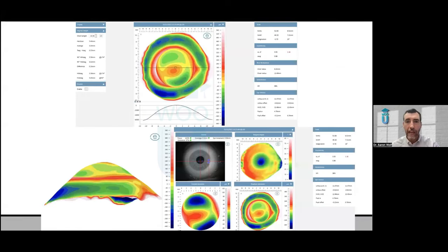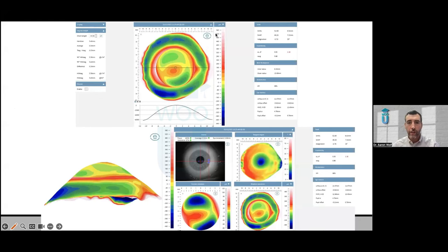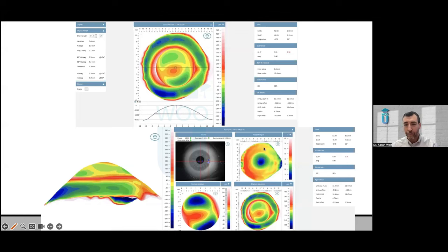These are examples of Fourier projection profilometry maps. Where the red ring is marks your cornea. With elevation maps, warmer colors are higher and cooler colors are lower — you can even see a little pinguecula off to the nasal side. The shades of green and blue tell you about the elevation and curvature of the sclera, and in the bottom right you can see corneal elevation. You also get an assessment of map quality for dryness, infrared imaging, and a 3D recreation of the eye.